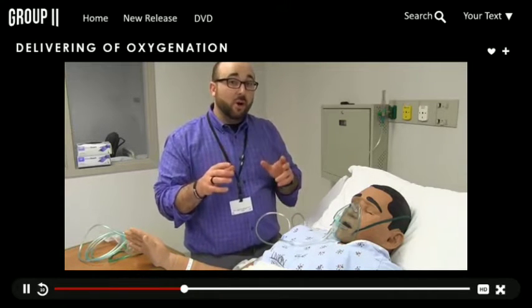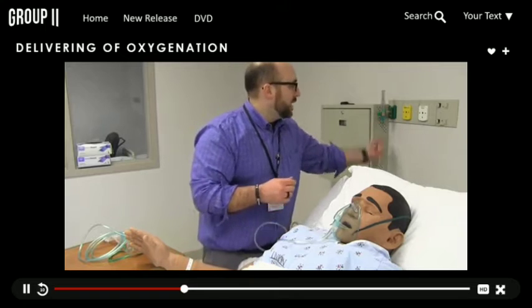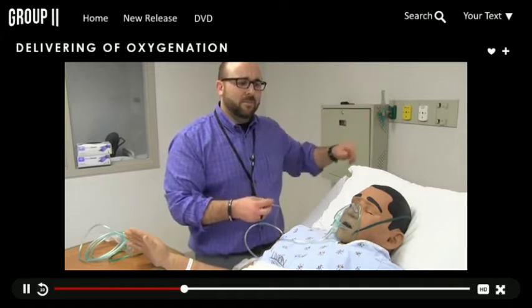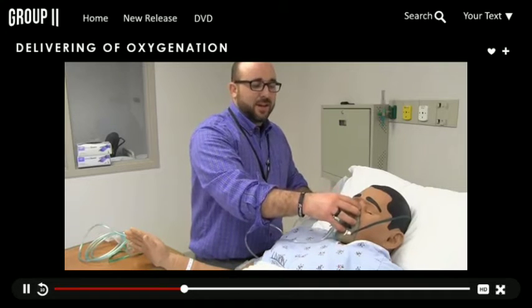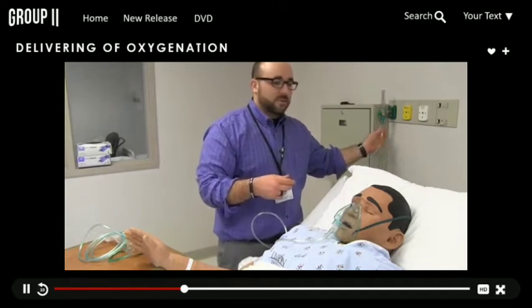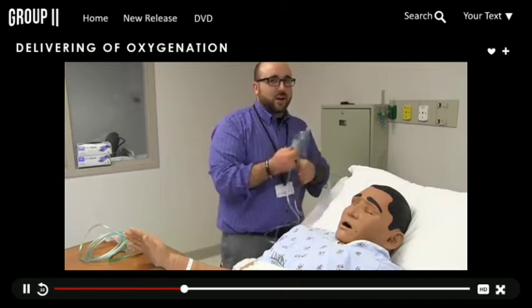So one thing to note with this, you notice there are also holes in this part of the mask and in this part of the mask right here. In case the flow would be shut off and no longer come into the mask, it will fog up, so you'll know something happened. Plus you can hear the flow meter running back here. But the patient will still be able to breathe. This isn't sealed to the face like a CPAP mask, so they'll still be able to breathe, but it will be uncomfortable after about 30 seconds to a minute. So it's just one thing to look out for. So that's the simple mask. You won't see a lot of those around, but just in case you do, it's a kind of generic oxygen device.